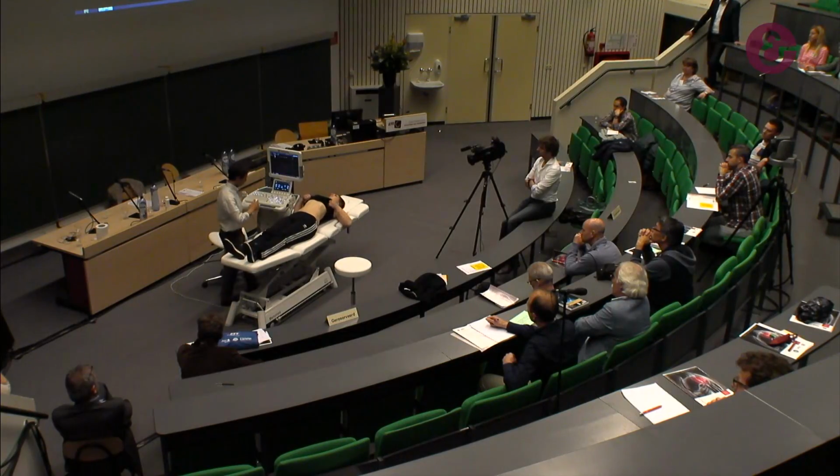So if our purpose is to change how people move because they have a poor control of the posture and the movement, it's very important to be sure that the information we give is useful for them to improve, to learn, and to remember the exercise. So we will start with the anatomy.